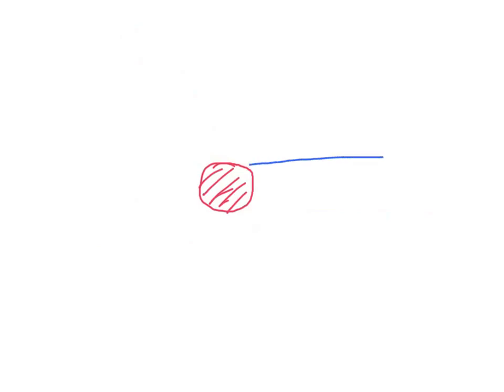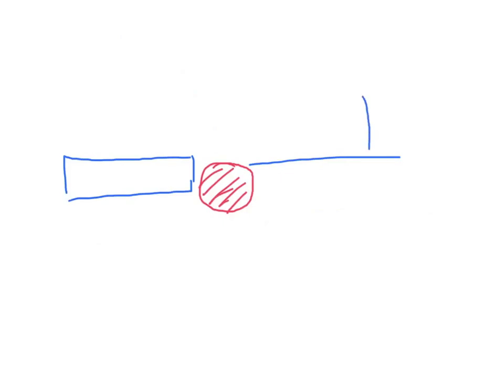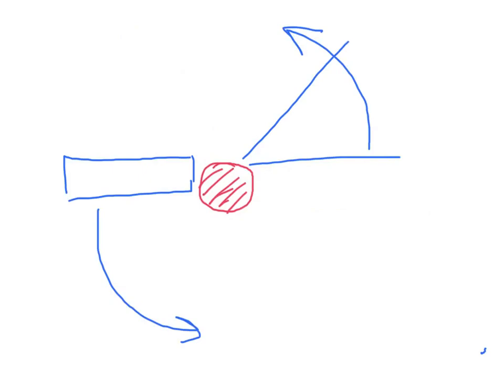Now, what about the opposite situation where the needle is on the far side of the lesion rather than the near side? We'll just do the opposite. Instead of rotating clockwise like we did previously, this time we're going to rotate counterclockwise, and again we'll end up with our needle in the center of the lesion.